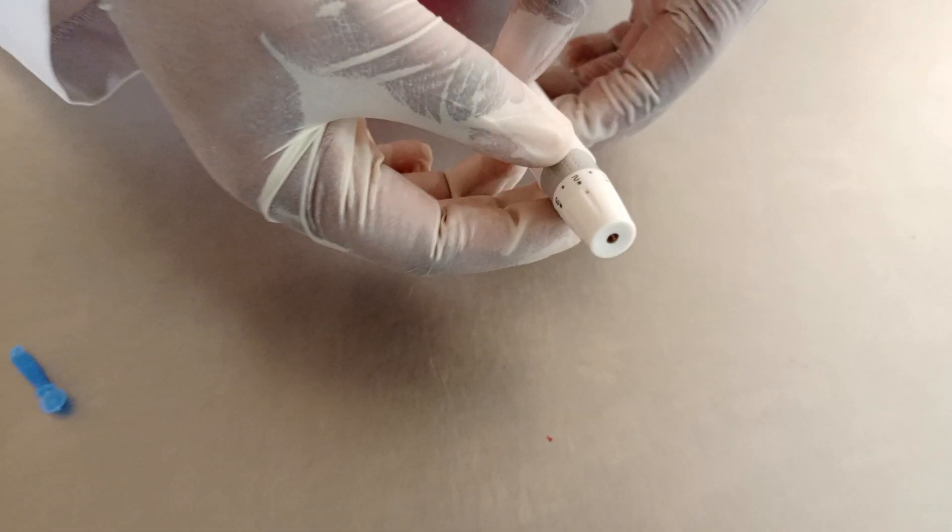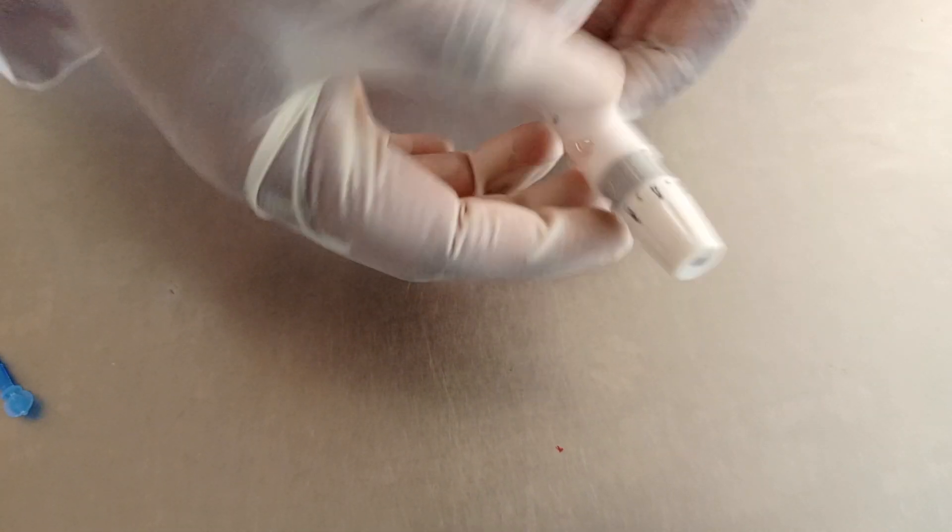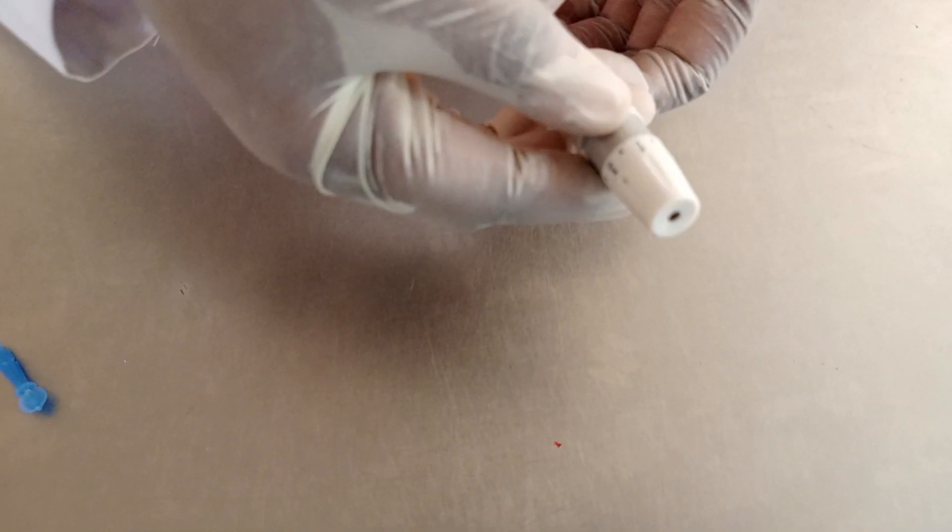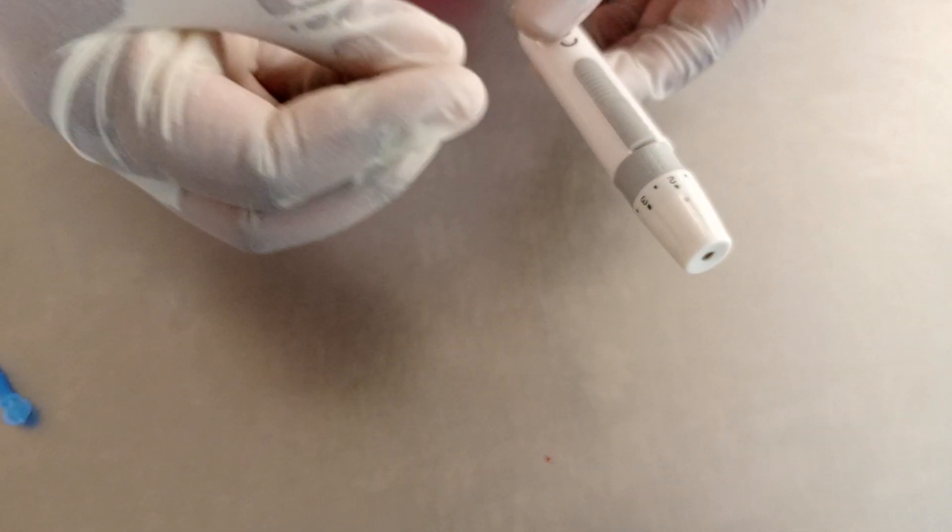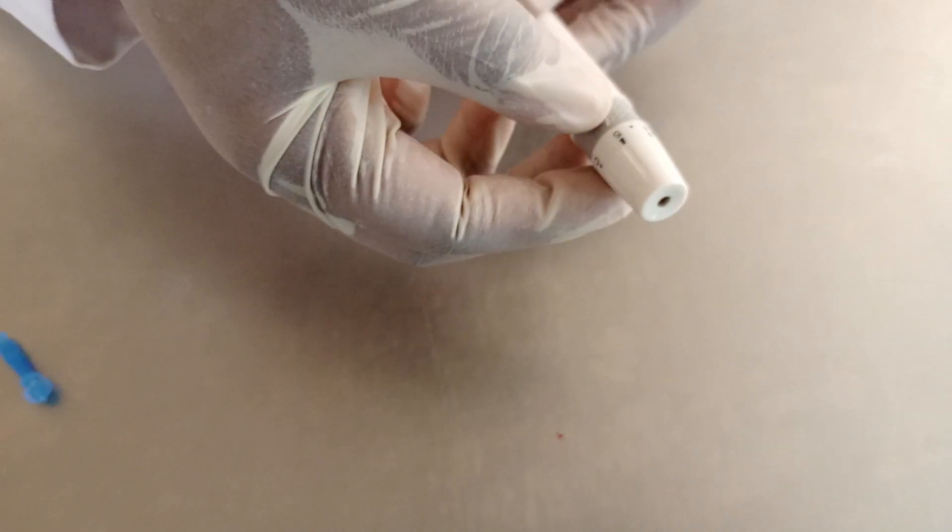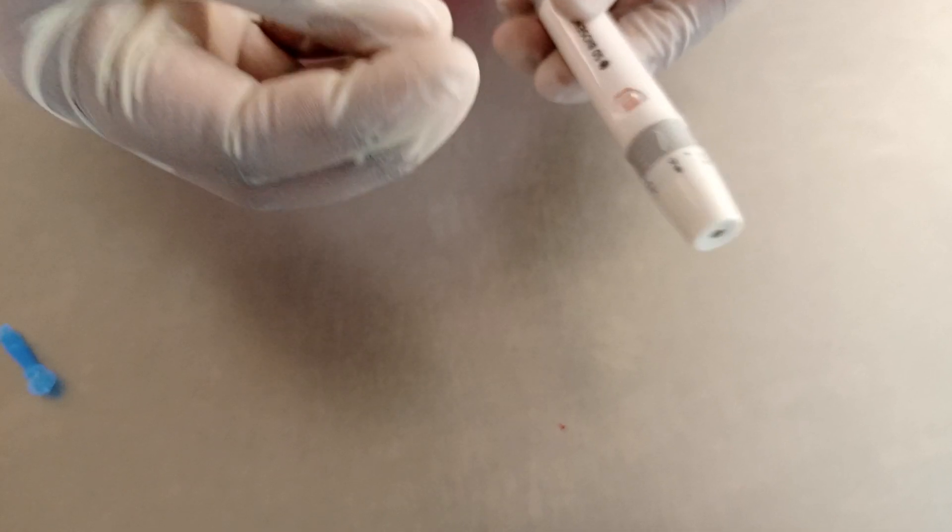The Elascent device has numbers from 0 up to number 5. The smaller the number, the thinner the skin of the patient you want to inject. And the bigger the number, the thicker the skin of the patient you want to inject.